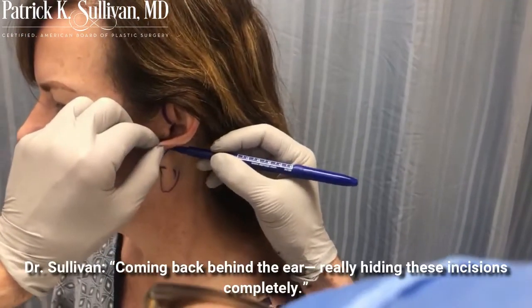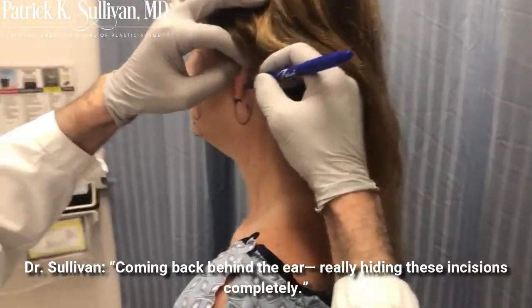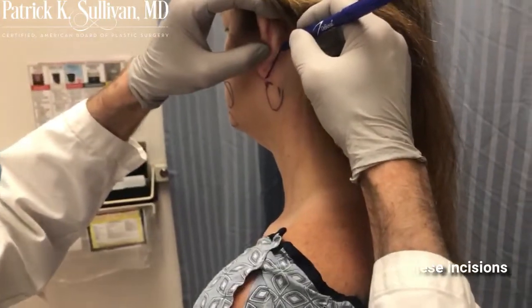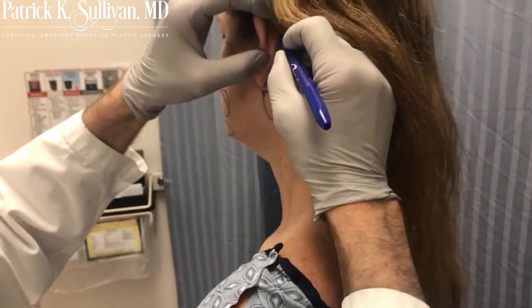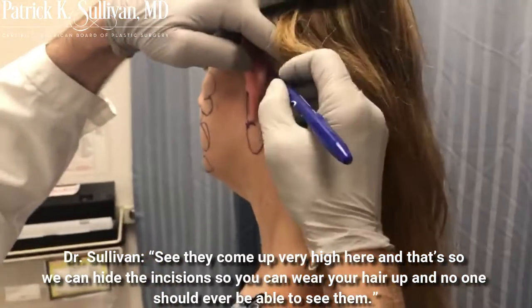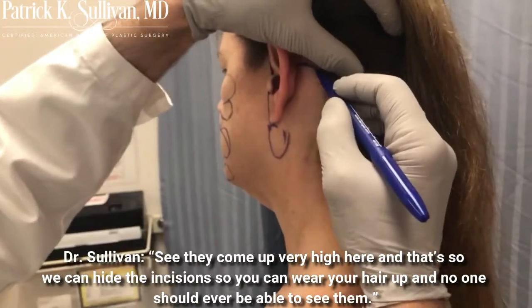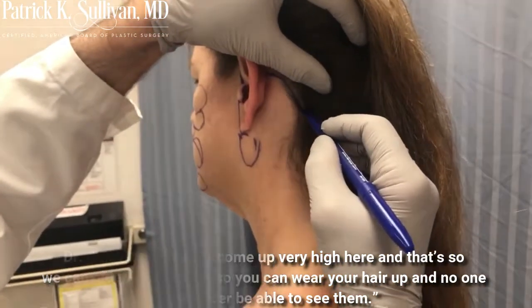Coming back behind the ear, really hiding these incisions completely. You can see that we can come up very high here, and that's how we can hide the incisions so you can wear your hair up and no one should ever be able to see them.